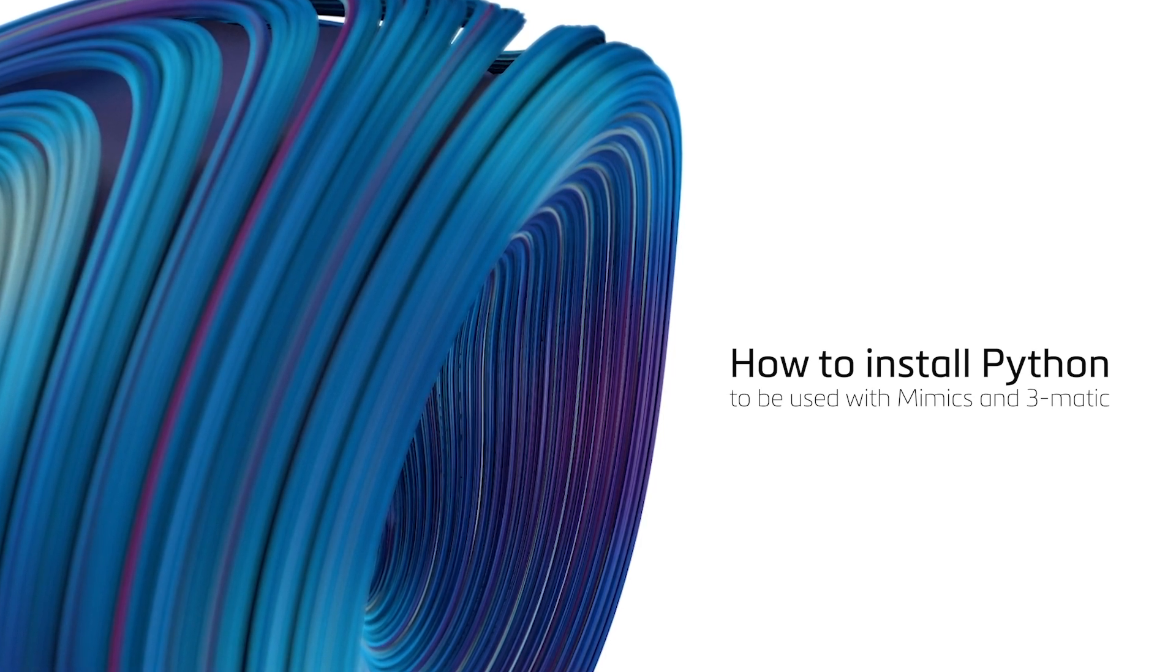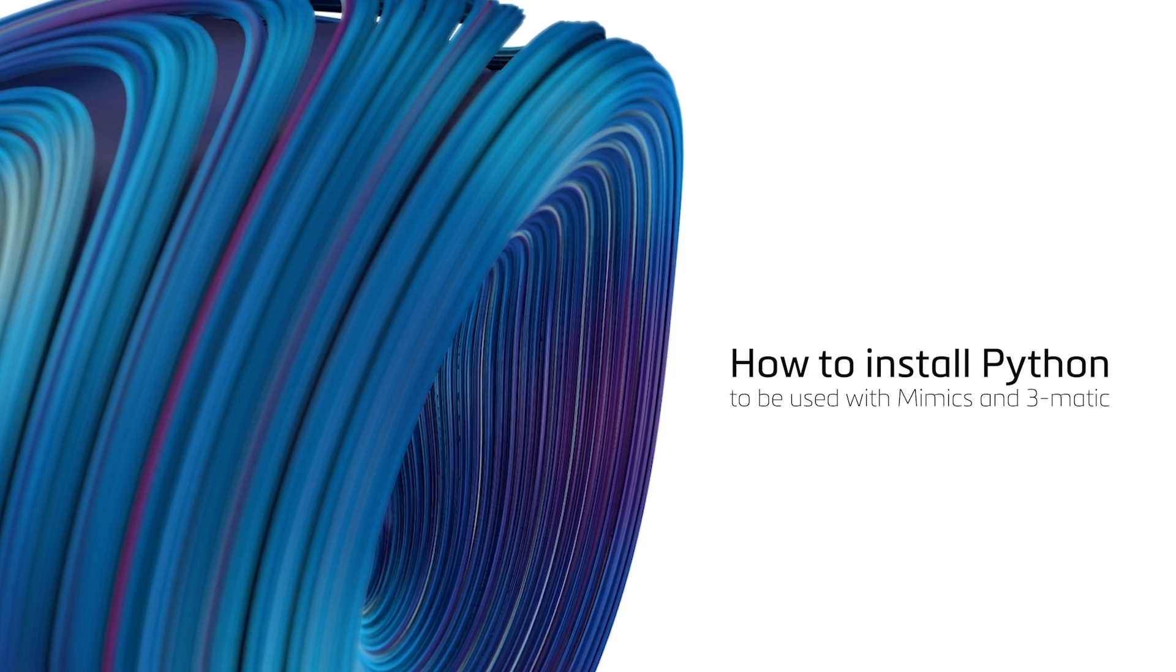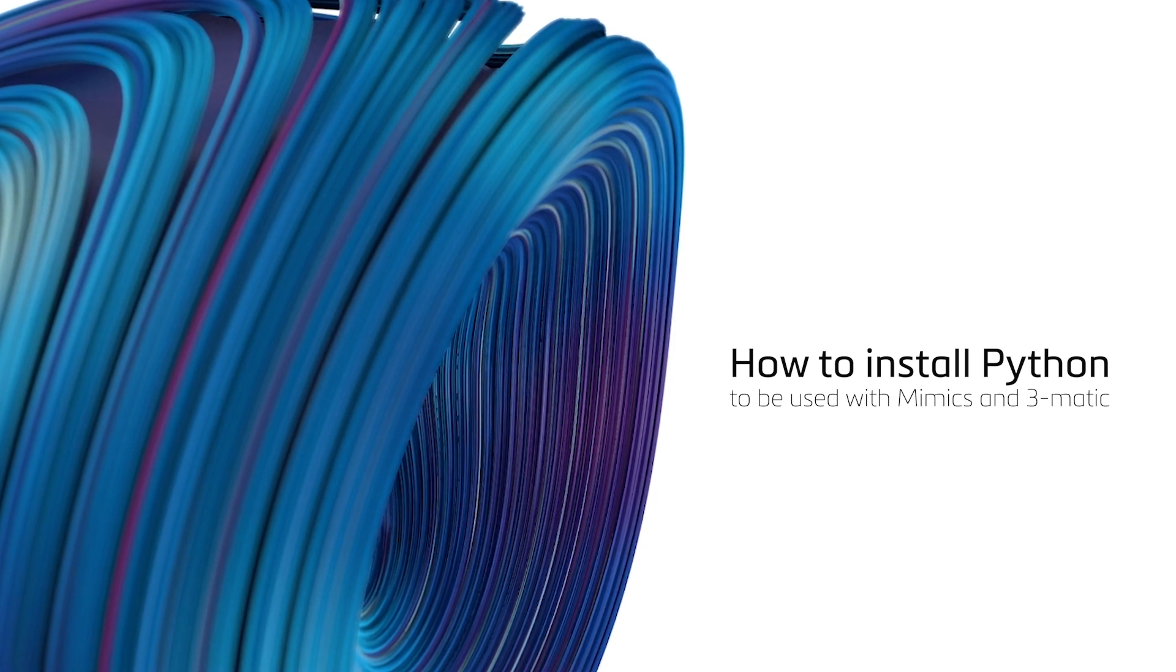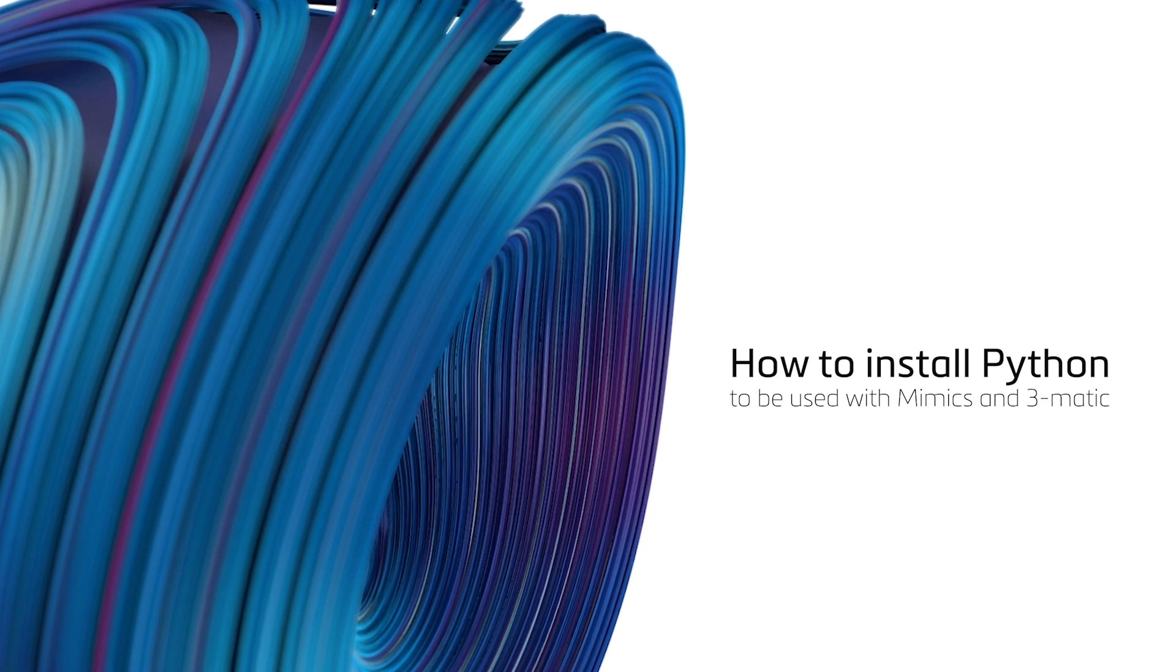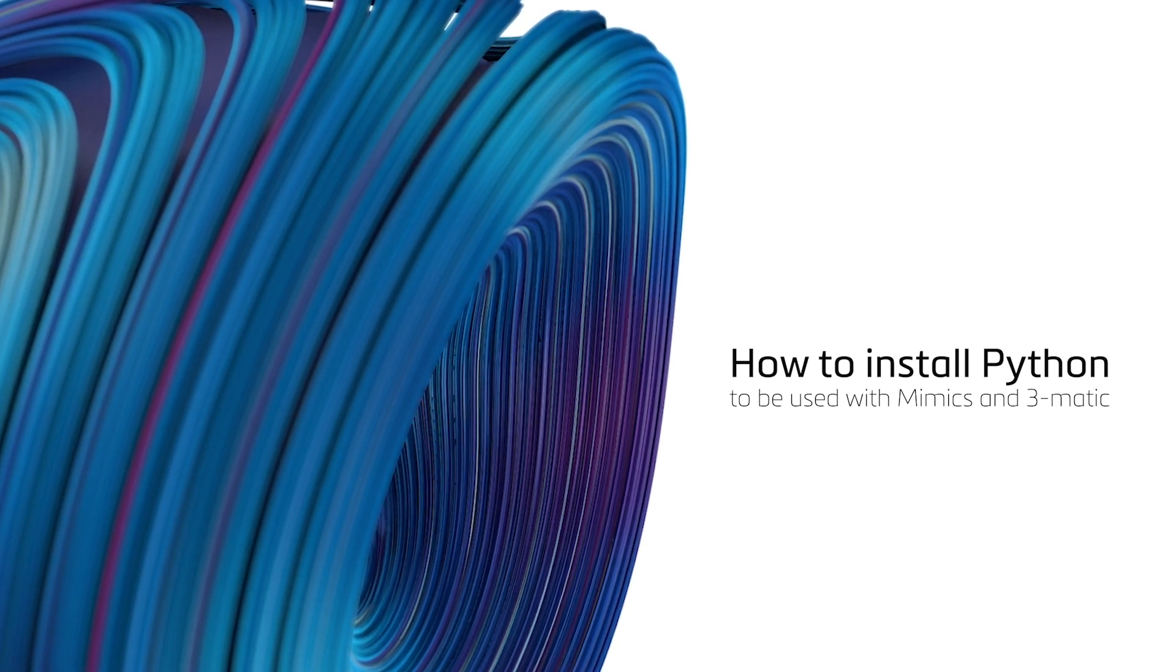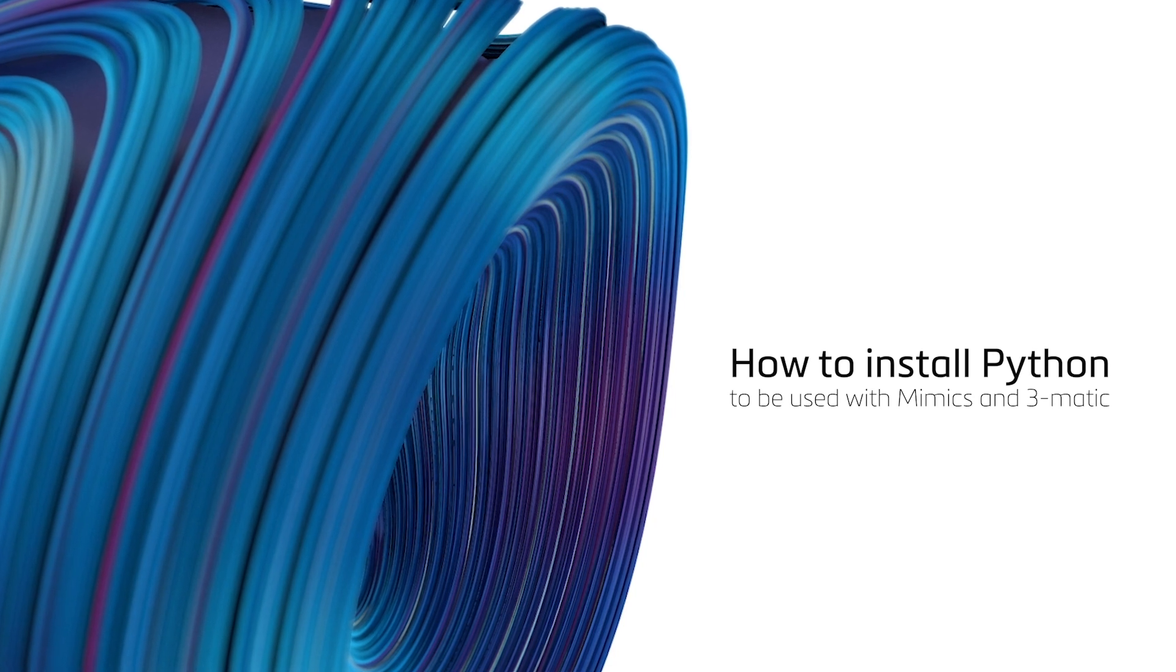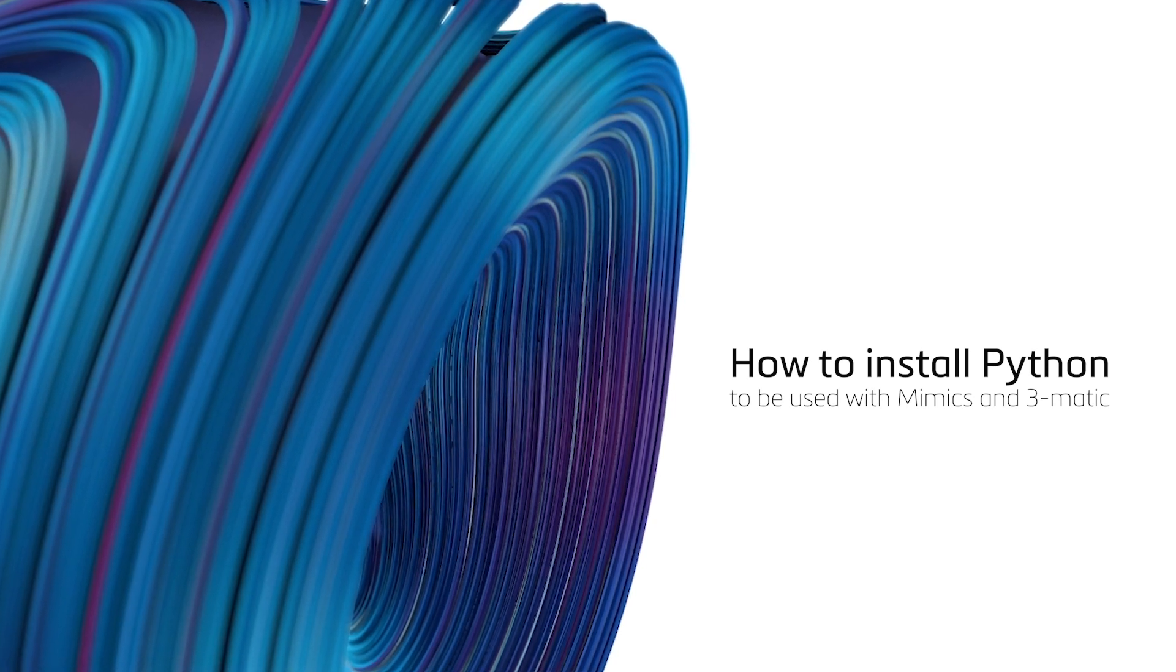This will allow you to automate your workflows by creating scripts for them in Python. Today, I'll be demonstrating the installation of Python and how to configure Mimics and 3-matic to start scripting. This configuration will also include downloading some Python packages.